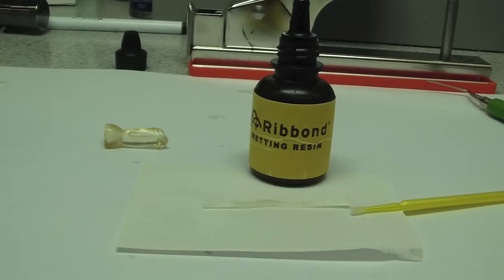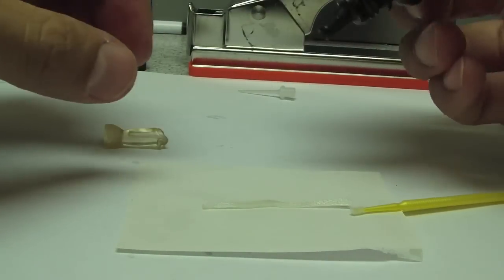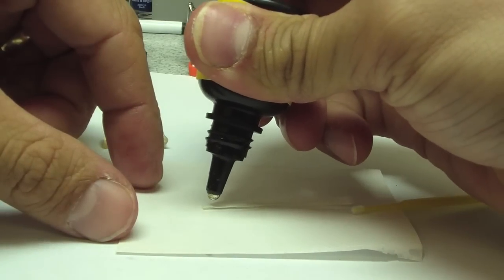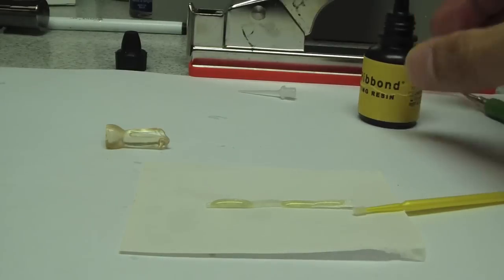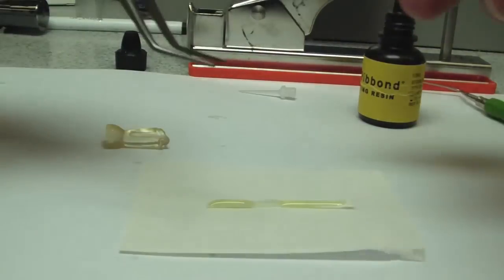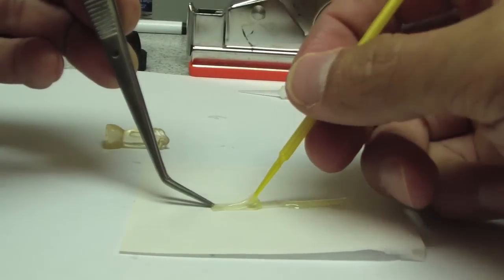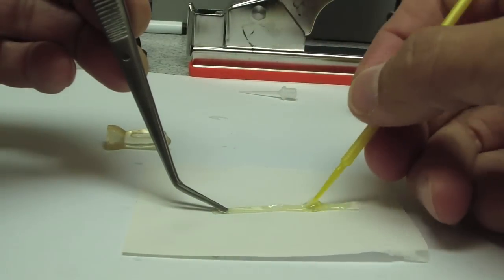Once you place it onto the ribbon, cover it and make sure it doesn't get cured. I would next time have another piece of ribbon ready—we'd have three strands, one long one like this that you see in front of you and another shorter one which will also be condensed into the canal.